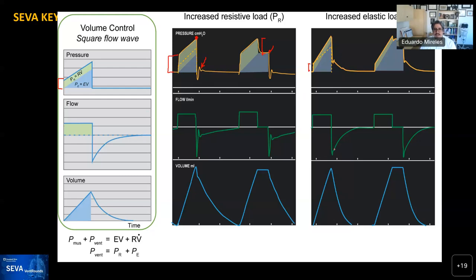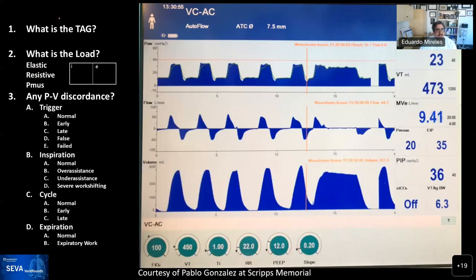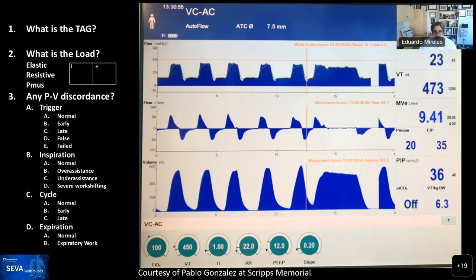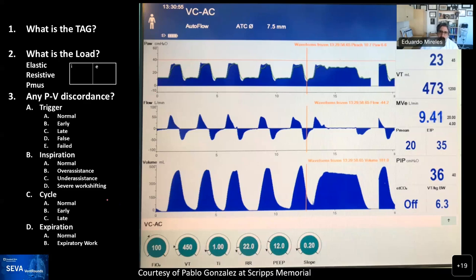The first case today was submitted by Pablo Gonzalez from Scripps Memorial — he's a respiratory therapist there who sent us this really nice waveform on a Draeger ventilator. In our classic manner, I'd ask you in the chat to put the tag: what do you think is the load for this patient? And then if you see any patient-ventilator discordance — trigger, inspiration, cycle, and expiration. Take a minute to look at the waveform and start typing your thoughts.